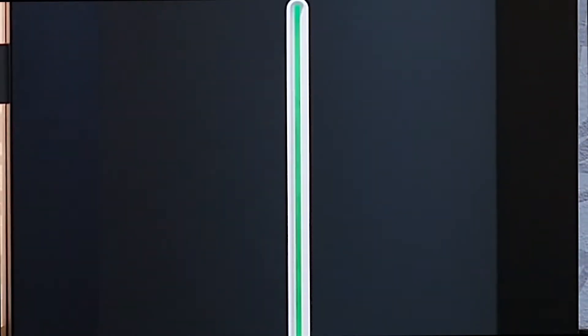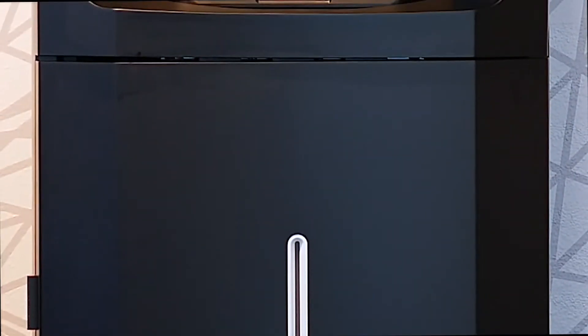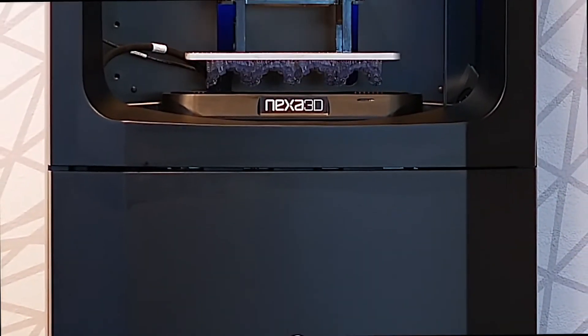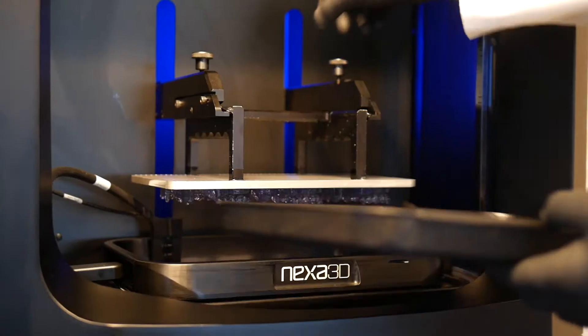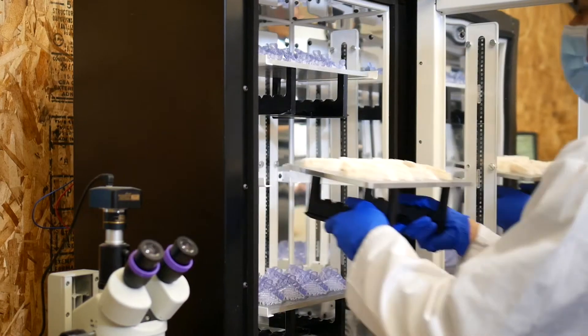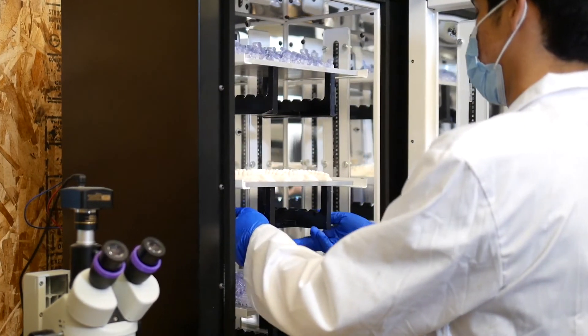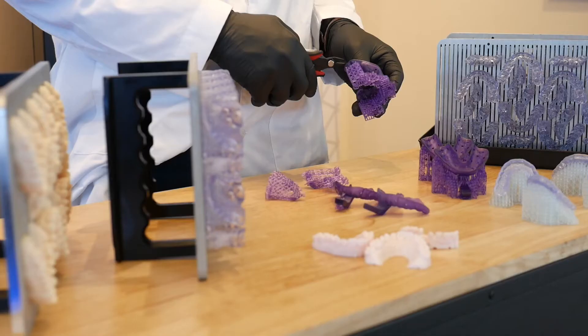Nexa 3D brings dental labs and clinics a new level of productivity with the NXT 200 ultra-fast printer, capable of producing thousands of dental models per day. Increase throughput and reduce costs with 20 times productivity gains on dental models using validated key print materials and workflows. A perfect fit for large or small labs, the NXT 200 is a scalable platform with low cost of operation.